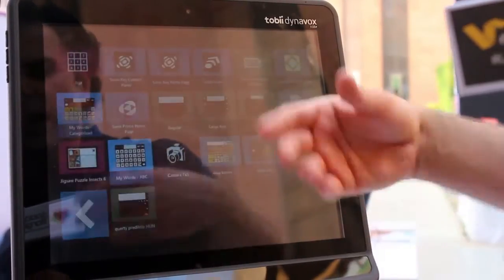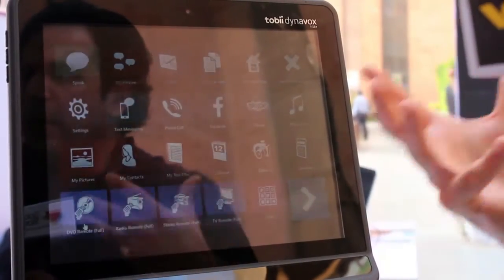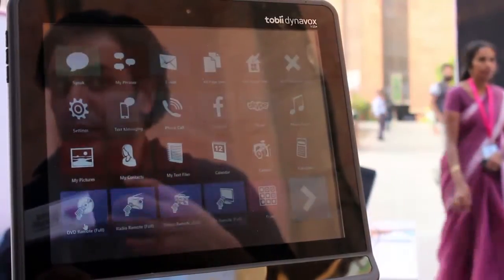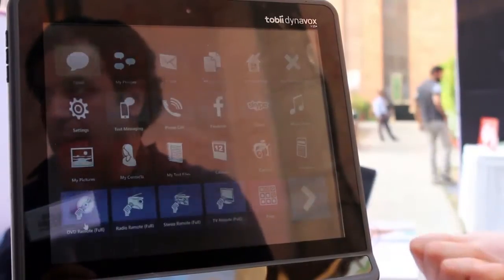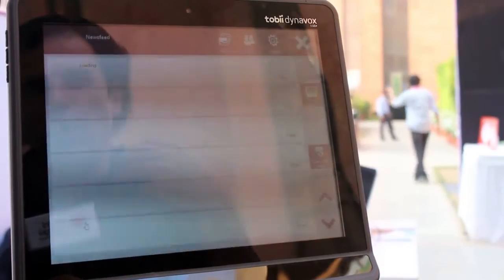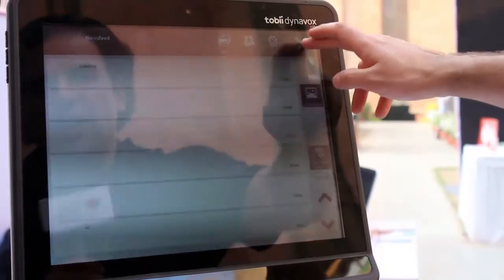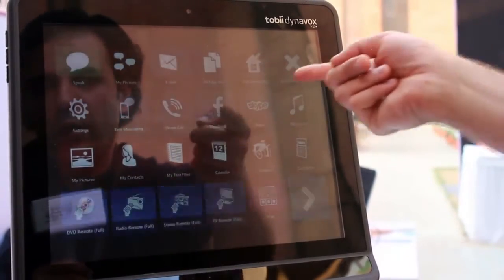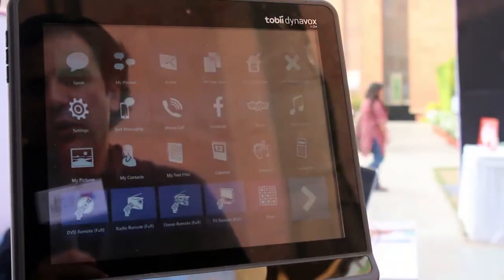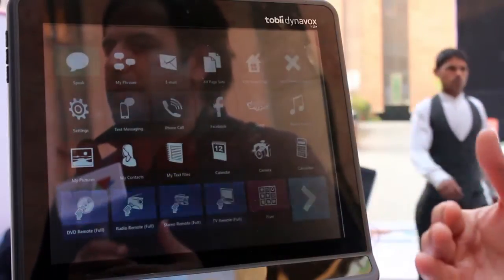Having said that, it's not only about typing or expressing things. There are also a lot of different arenas. Like one area where people with disabilities actually are very much included, if they have the right access methods, is social media. So if I give somebody with a physical disability a way to post things on Facebook, of course, then they are a part of the social media community. Yeah. So it's actually a very good tool for inclusion if people are able to use Skype, to use Facebook, to use email, etc.